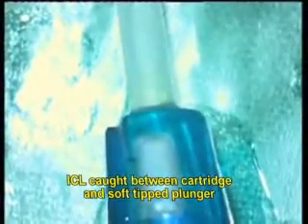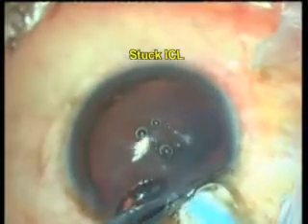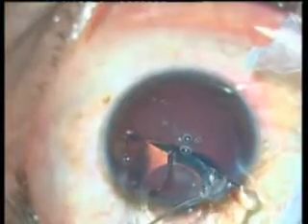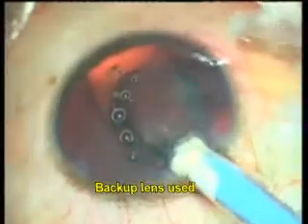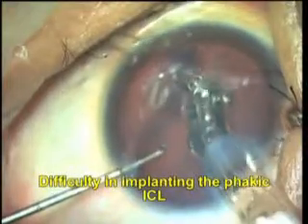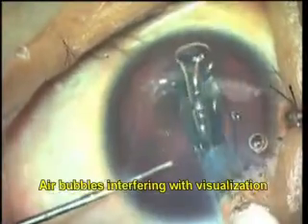Improper loading of the ICL into the cartridge can lead to difficult implantation. An improperly loaded ICL may get stuck in the cartridge and not get injected into the AC. Forceful pushing may lead to tearing of the ICL and inability to implant it. Having a backup lens may be a good option for beginning surgeons. It is important to avoid air bubbles in the cartridge which interfere with visualization.